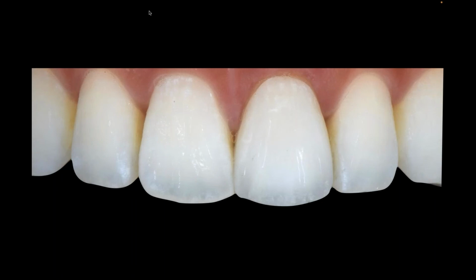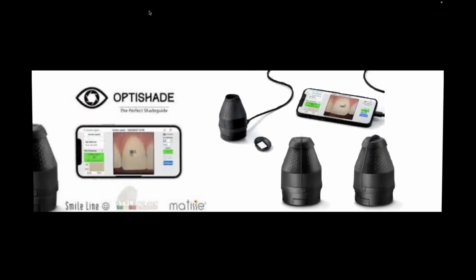Look at the chroma or the warmth in the cervical third, look at the value in the middle third, and then you look at the effects on the incisal as I get towards the incisal third. You'll see that we hit all those right. And not only did it confirm on the polarized, but it also confirmed when I shot it with my Easy Shade. So I had the best of both worlds, and I could evaluate how close I was before I sent that case back.